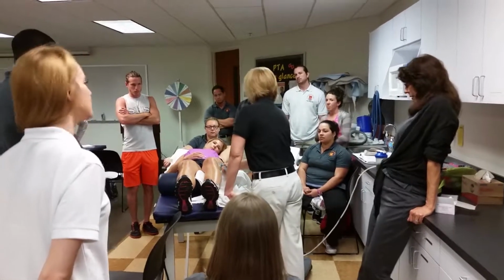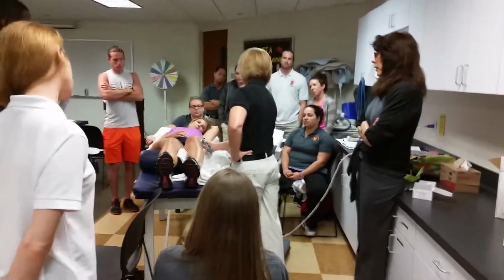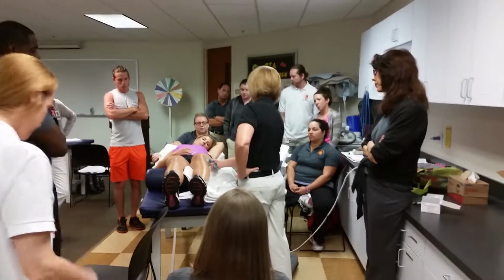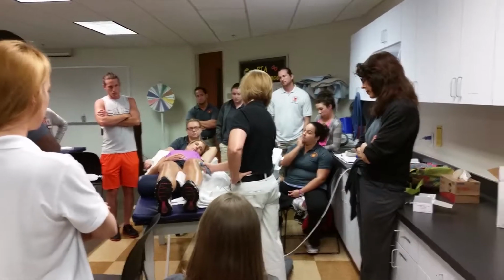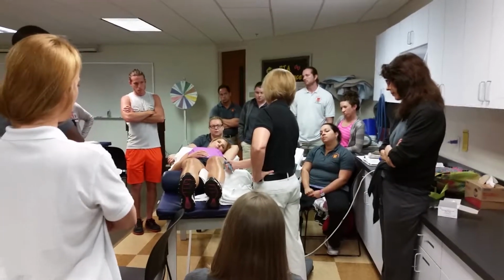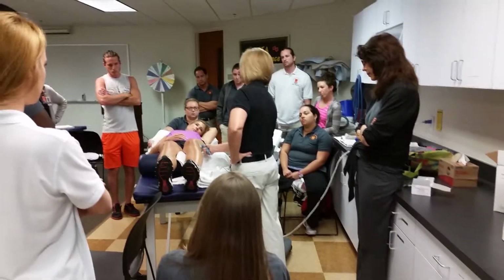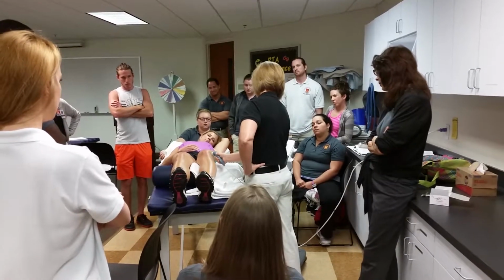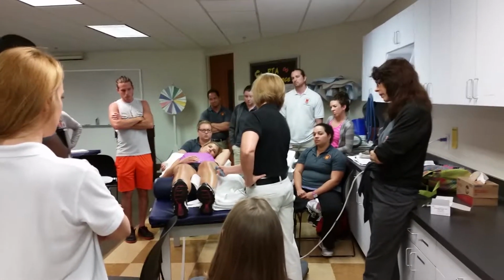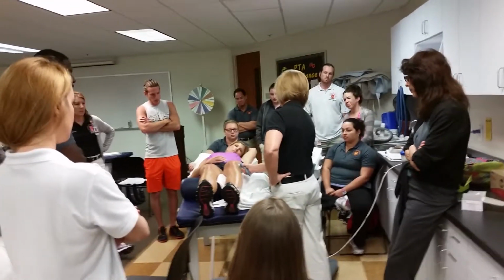So you can see now that it's kind of a long time. So you want to be making sure that you're in a good position and you're comfortable, and that your arm is in a good position. You don't want to be delivering this in an awkward position, because you will fatigue out, and then you'll be like, oh God, I have 4 minutes left. Okay, so make sure you're comfortable, they're comfortable, you're in a good position. All the supplies that you have are here.